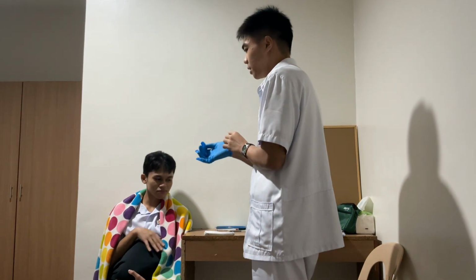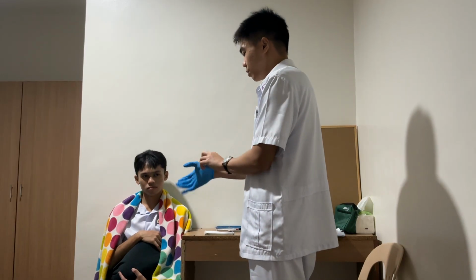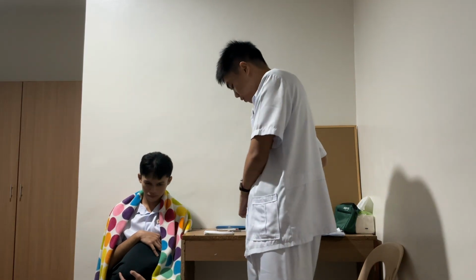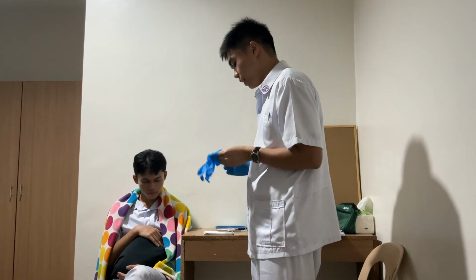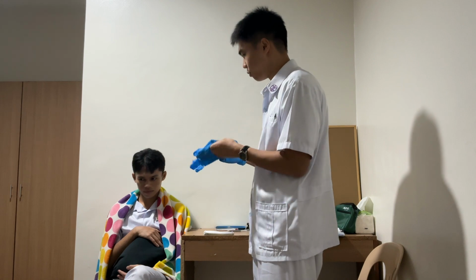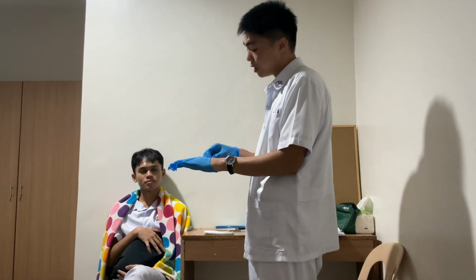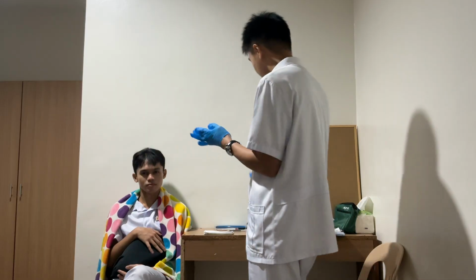Then along with that is the respiratory rate. With the respiratory rate, we get to see if you're breathing normally, or is your body compensating for it? Are you breathing faster? Are you breathing slower than normal? Then lastly, we have the blood pressure, which we take with what we call the BP apparatus, and the technical term for that is the sphygmomanometer.